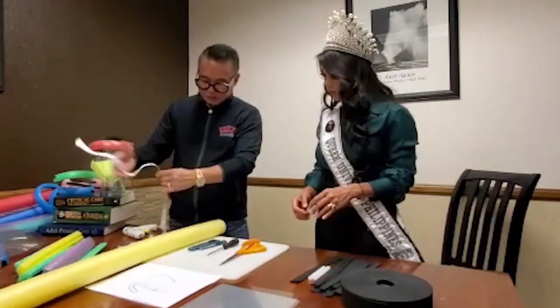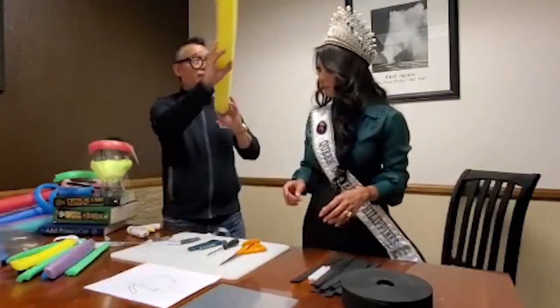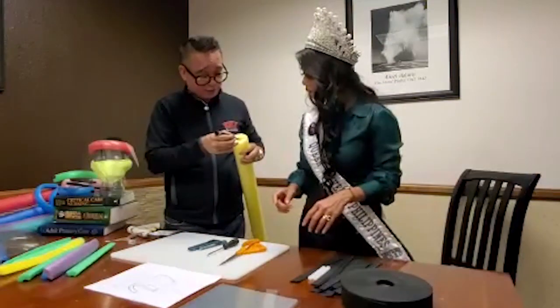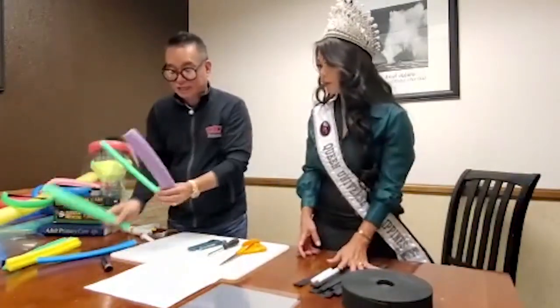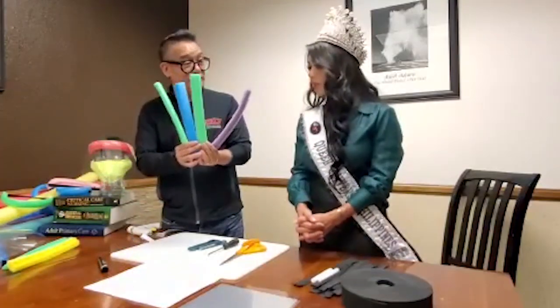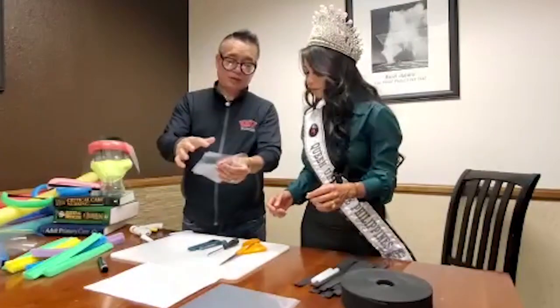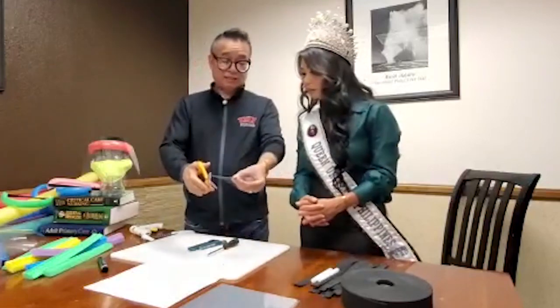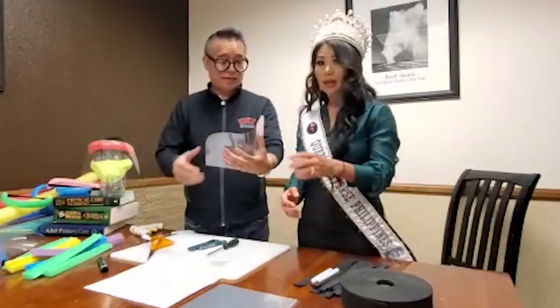So first, Ness, we need to cut the floaters or the pool noodle. Make sure you cut about 12 inches. That's enough around here. You want to make sure that you divide it into 4. You divide it into 4. That's a good idea. You will have 4 of these cut pool noodles. Each one is actually one shield already. So how are you going to do this one? You can fold this a little bit so that there will be a rounded edge so that it will not stick into anybody's neck. So all you got to do is make a little round and put it there on the side.